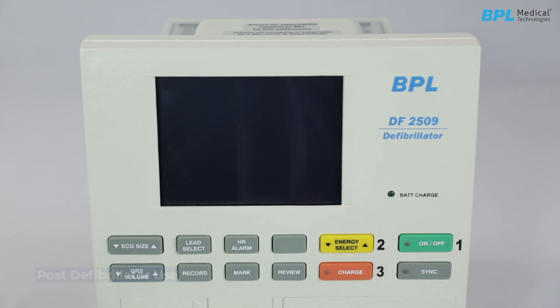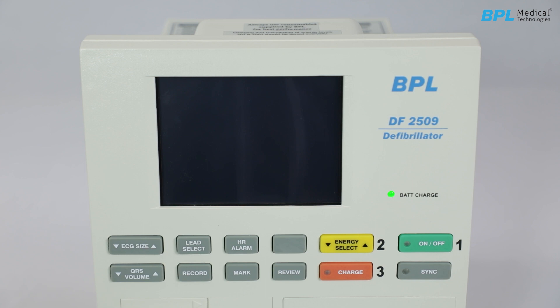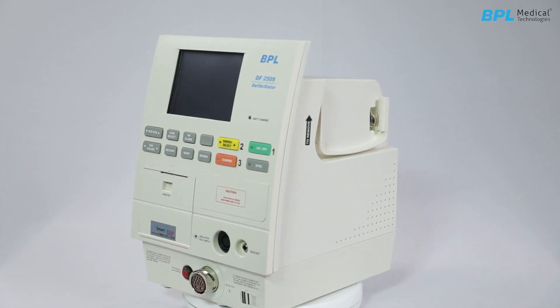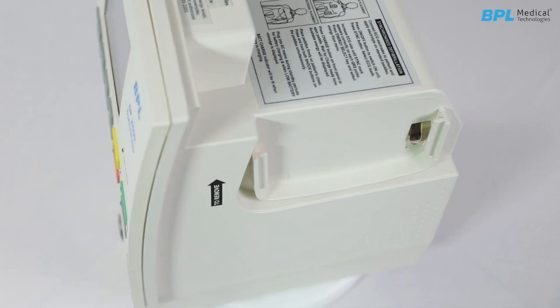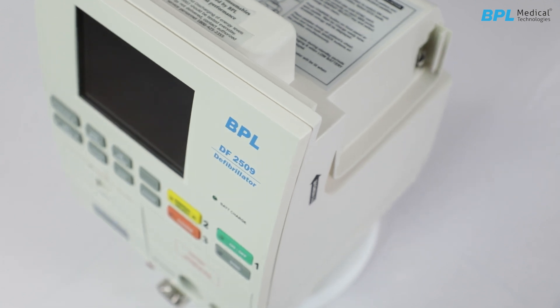Store the defibrillator. Connect the AC mains power and ensure the battery charging LED is on. Confirm availability of recording paper, electrodes, and electrolyte paste for the next use. Always follow recommendations and safety protocols. This concludes the process of unpacking and operating the BPLDF2509R.